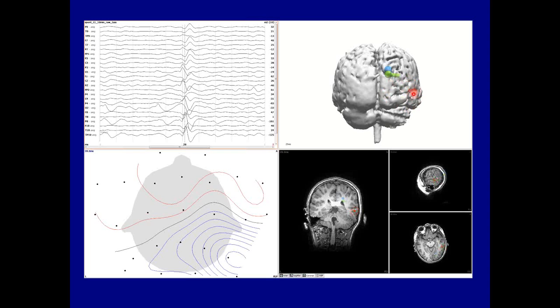So interestingly, if you went just with his major EEG spike peaks, you would get this propagation, probably localization out here laterally when the source was mesially. So here the MEG sensitivity was very important, and here MEG led the EEG, except for some little tiny components that you probably didn't pay attention to. So this was a good example of MEG leading EEG.